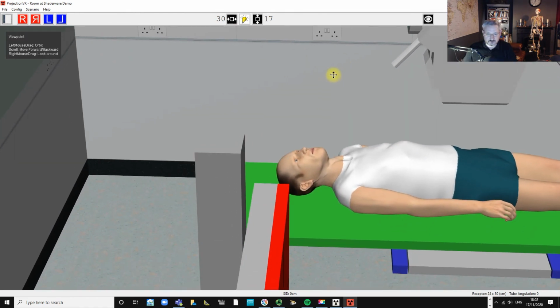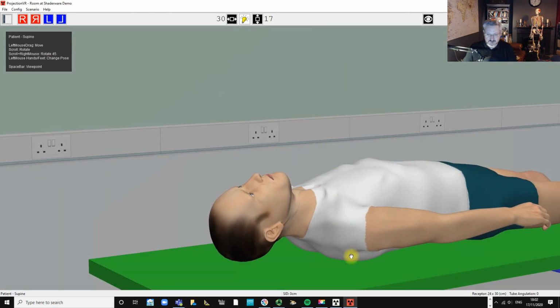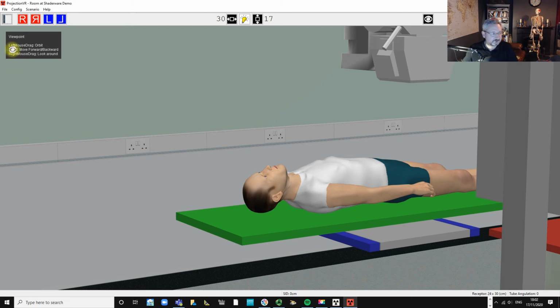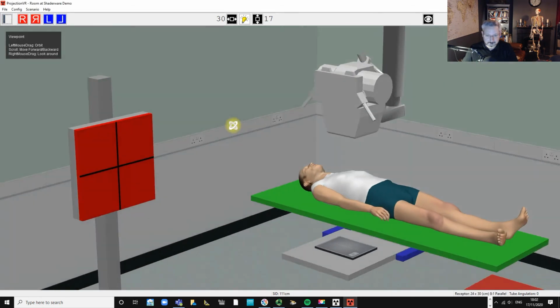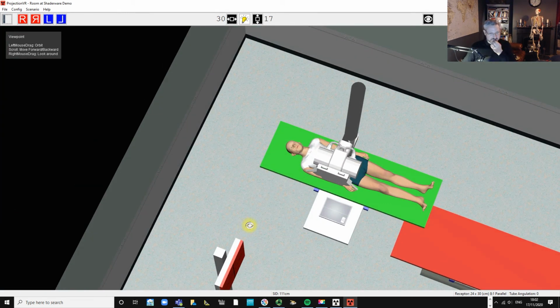Now, the problem you've got is that you wouldn't want to raise his shoulder up here to put a plate under here, because that would be quite sore, and getting him to rotate onto one side, he's clearly damaged his leg as well, so he's in a bit of a bad way. So this is where we would use this tray. So we're going to pop our receptor, and we'll put a grid receptor on here. Well, will we? This is the question.